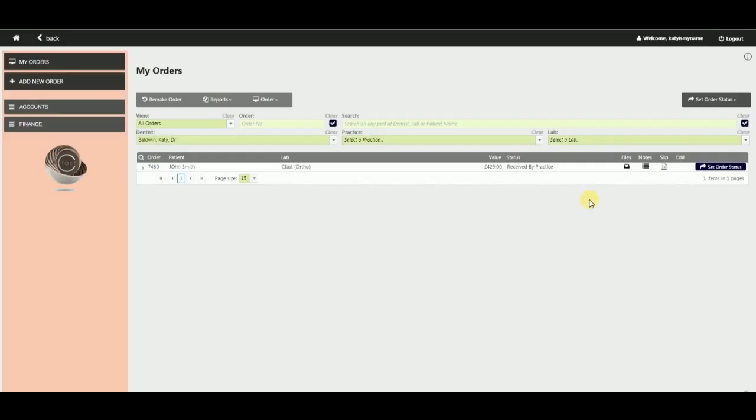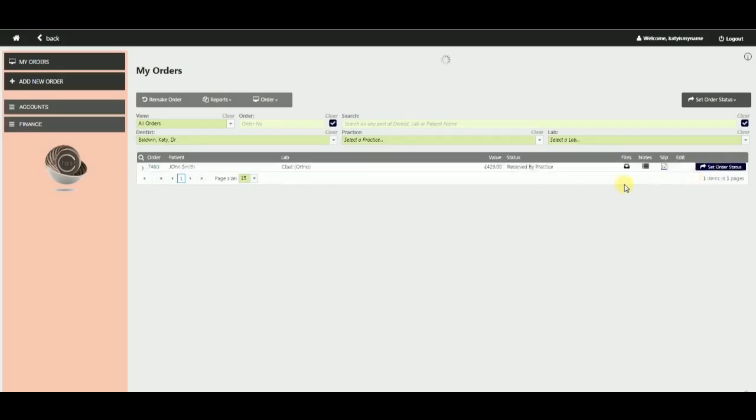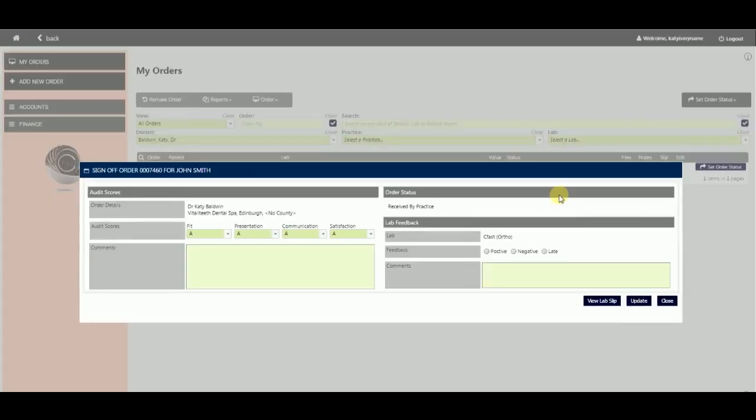Then you will need to log back on and sign off the order as completed. At this point you are given the opportunity to rate the case and give any important feedback to the lab.